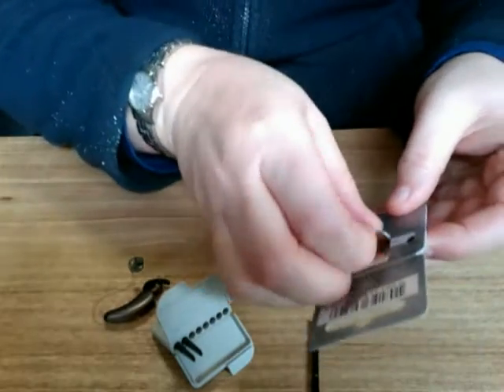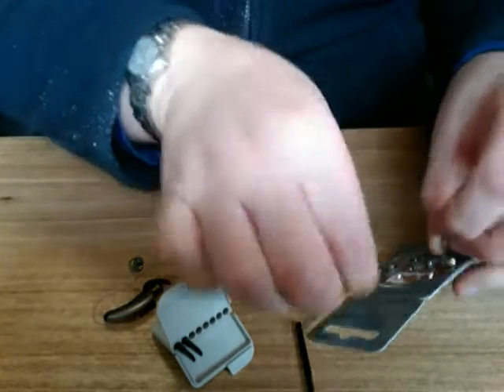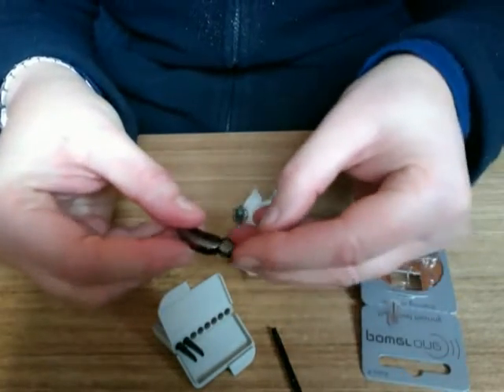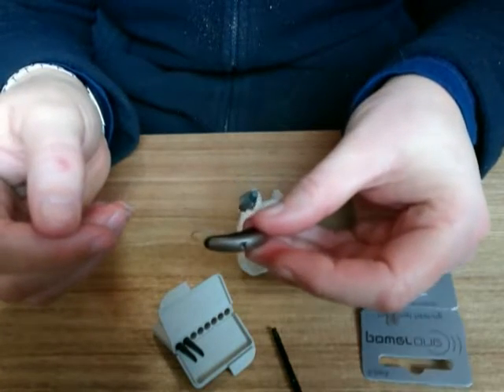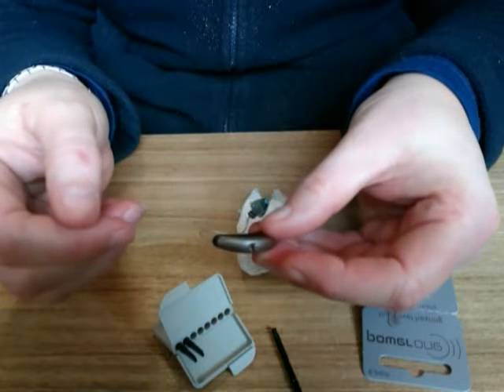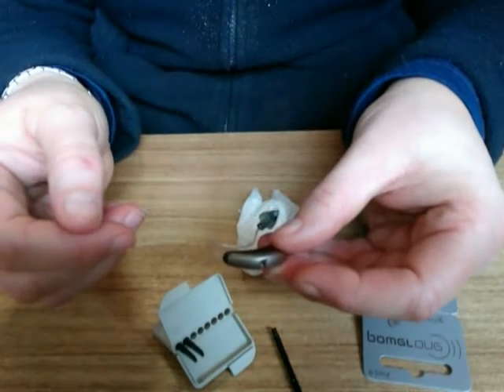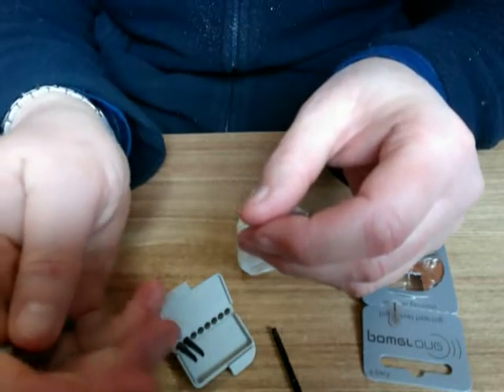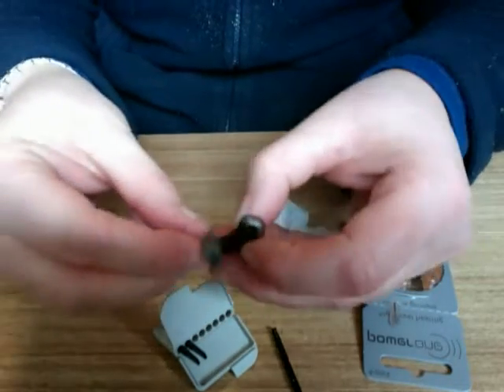Just place the battery in the aid and wait six seconds for the hearing aid to wake up. And there we hear the aid working again, so the pathway is clear.